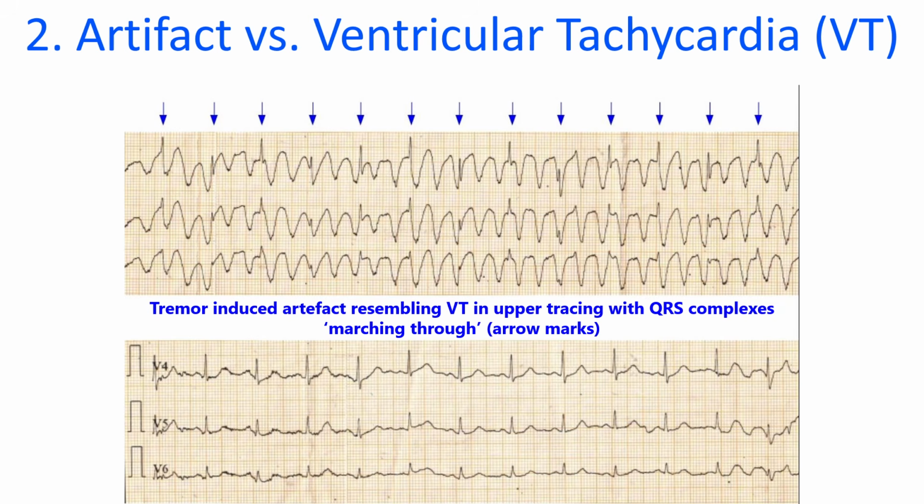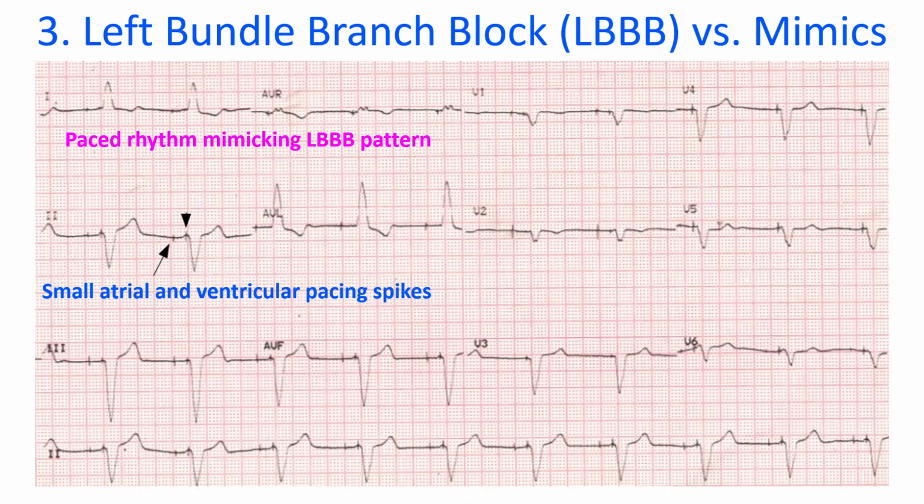Clinical tip: always check the patient, not the monitor. If the patient is sitting up and talking while the monitor shows ventricular fibrillation, check the electrode pads. Left bundle branch block versus mimics.